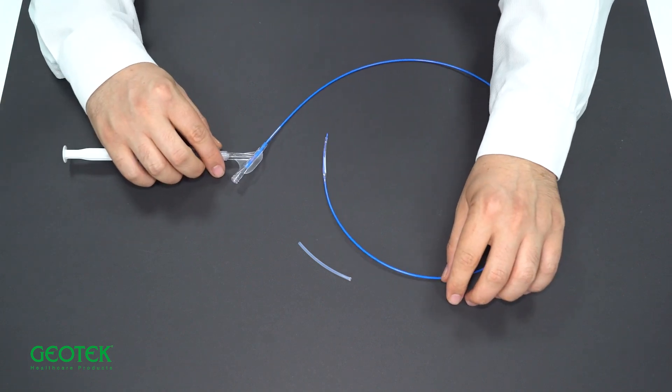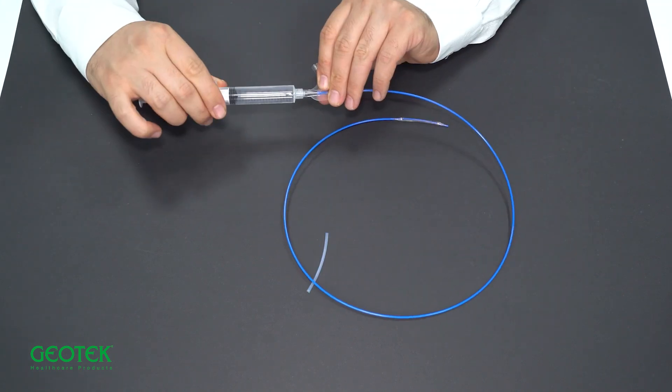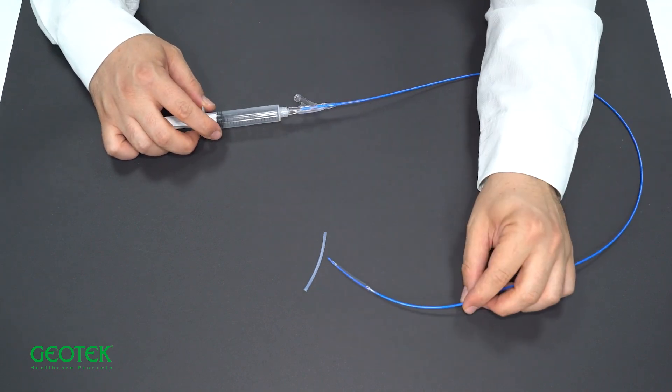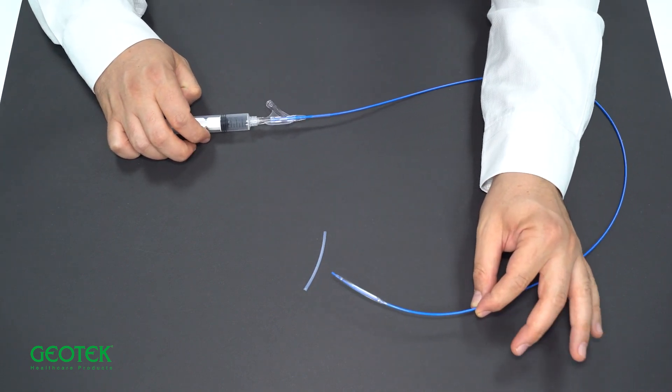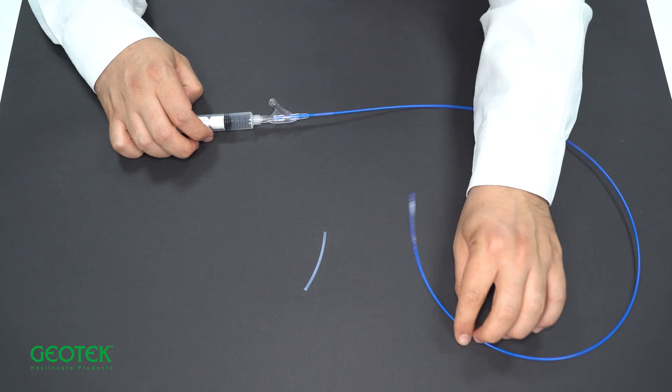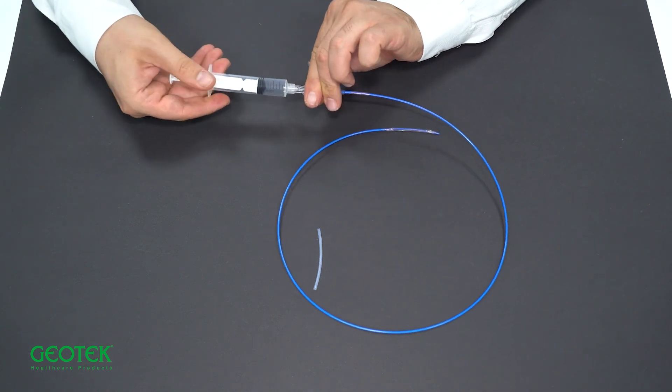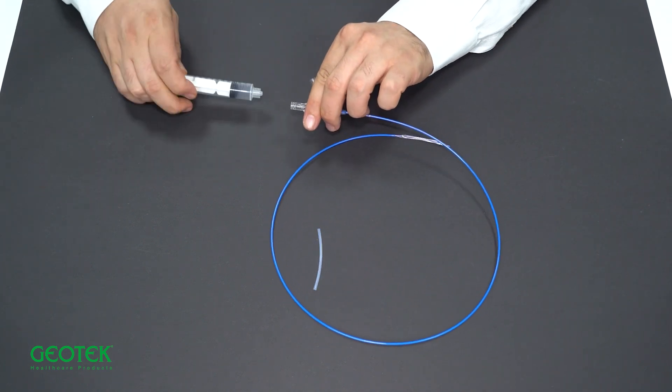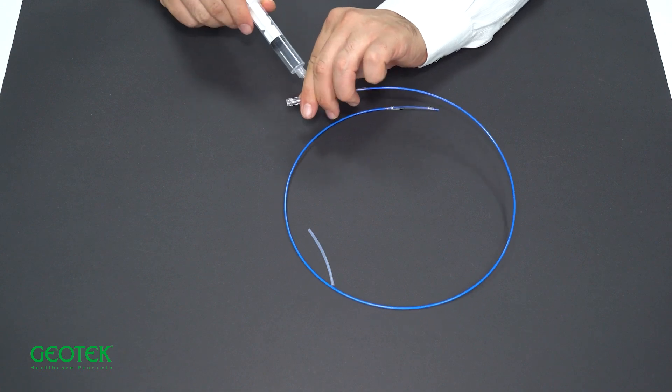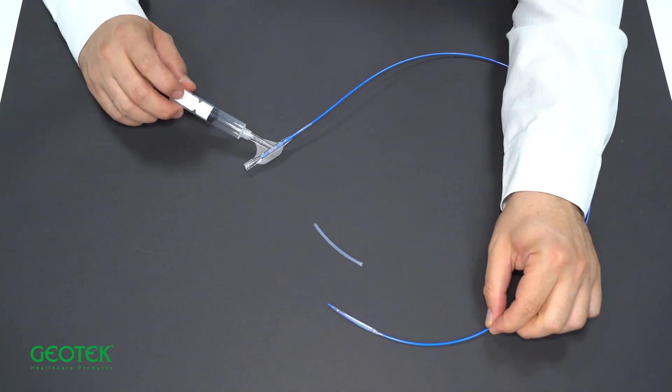Following the placement of the catheter, the location of the catheter is first confirmed by giving opaque material through the working channel. After the balloon is advanced and placed at the stenosis point, the balloon is inflated with sterile saline or a suitable fluid to expand the stenosis.